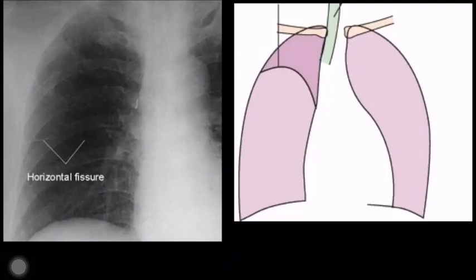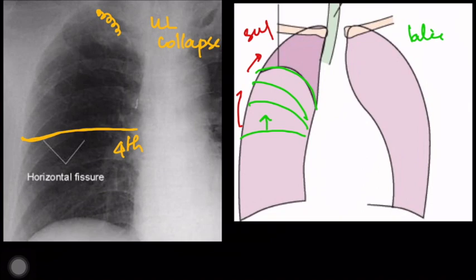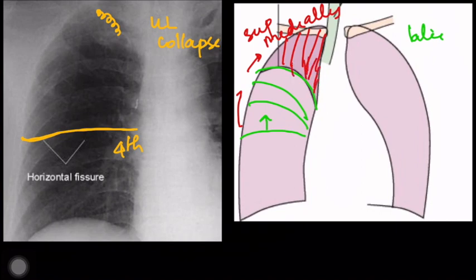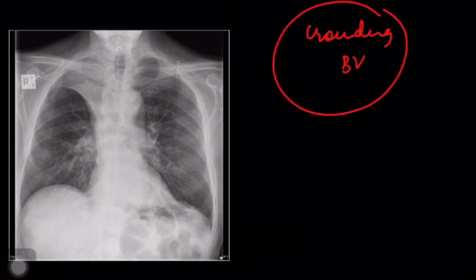Let's take a quick look. At the level of the fourth rib, we expect the normal position of the horizontal fissure. In the case of upper lobe collapse, this fissure shifts superiorly and medially, delineating a sharp border to the collapsed non-aerated lung parenchyma. Now let's see the third direct sign — crowding of bronchovascular markings. This is difficult to make out on chest X-ray and is appreciated better on CT scan.